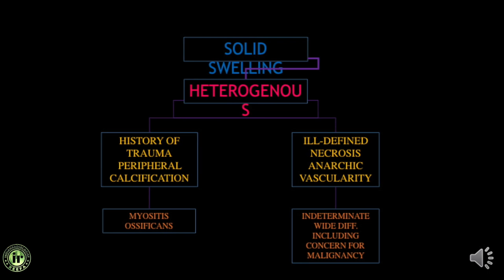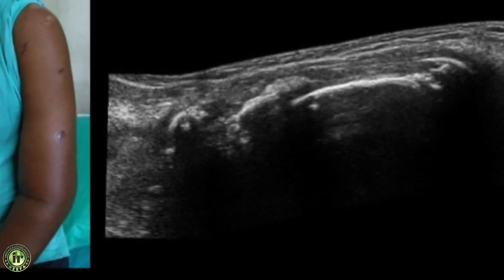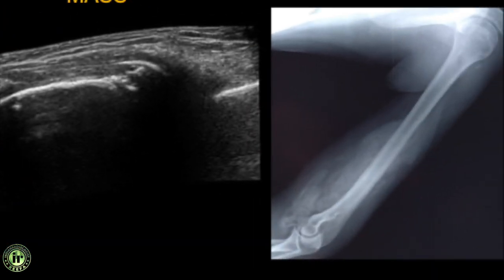Heterogeneous soft tissue swellings with a history of trauma and showing peripheral calcifications are usually myositis ossificans — always compare your diagnosis with a radiograph. A patient with left hemiplegia who underwent native massage presented with a tender, enlarging mass. Ultrasound showed peripheral hyperechoic calcified lines with strong posterior acoustic shadowing within the biceps muscle. X-ray was very convincing, showing sheets of calcification with a normal underlying bone. This is myositis ossificans, which is more common in patients with hemiplegia.